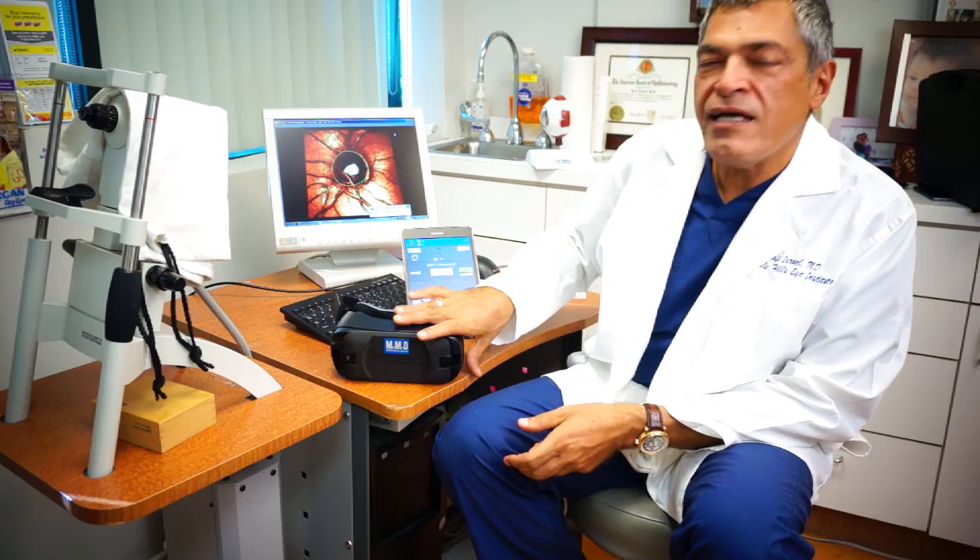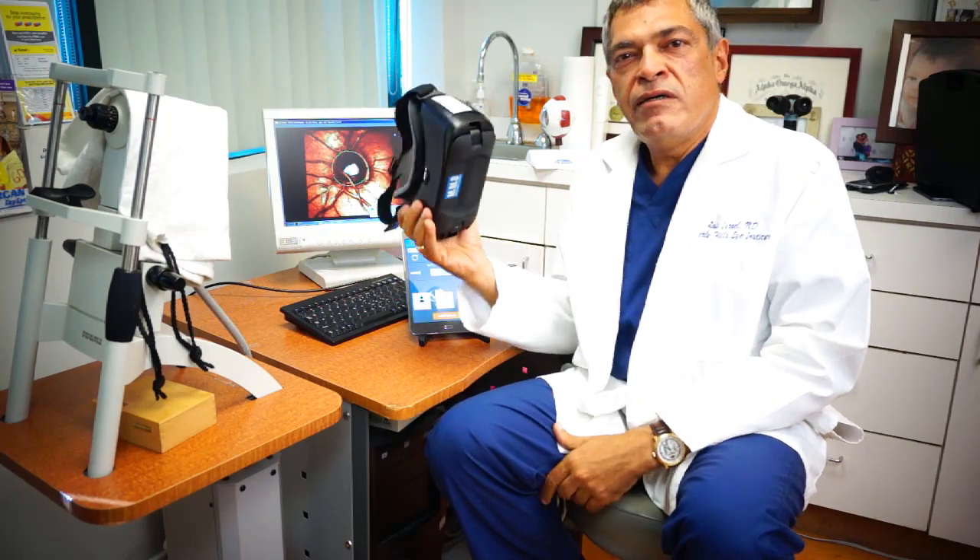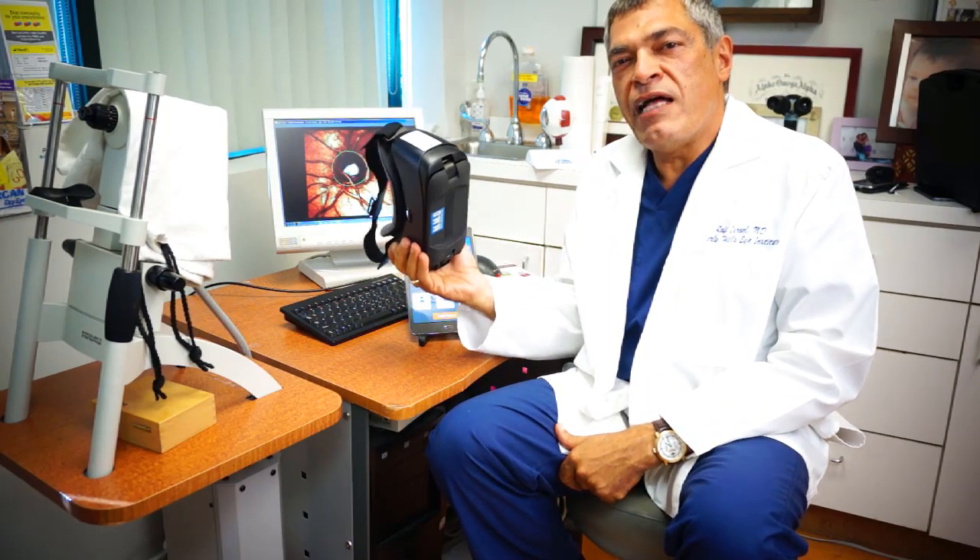Hi, I'm Dr. Rafi Israel. I'm a board-certified ophthalmologist and I'm excited to introduce to you the PalmScan VF2000 Virtual Reality Visual Field Analyzer.